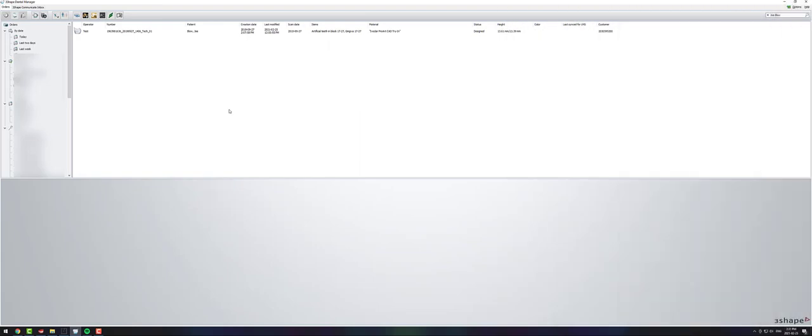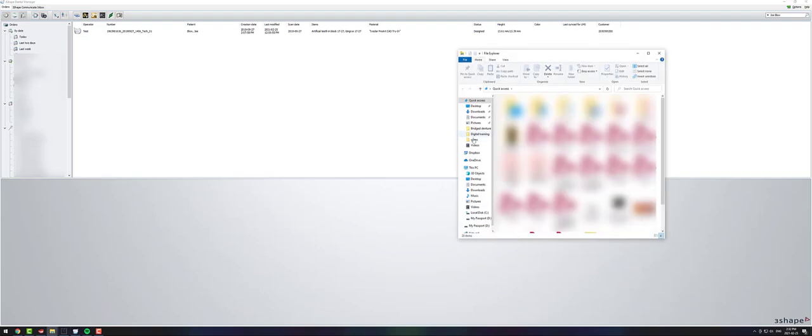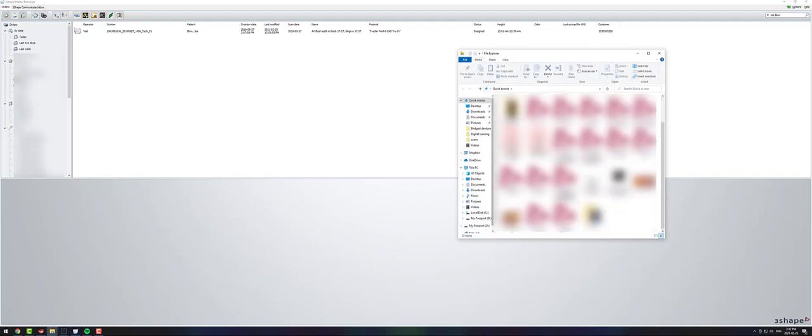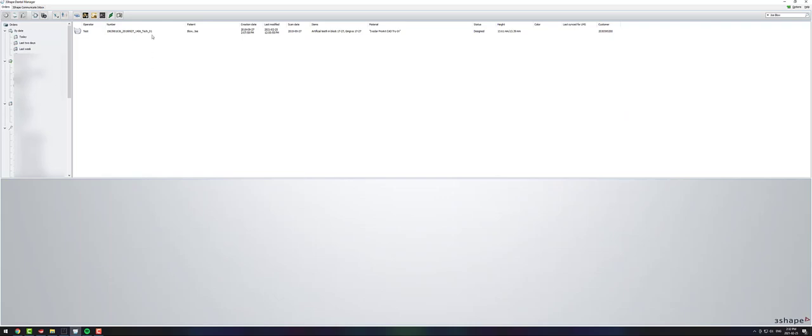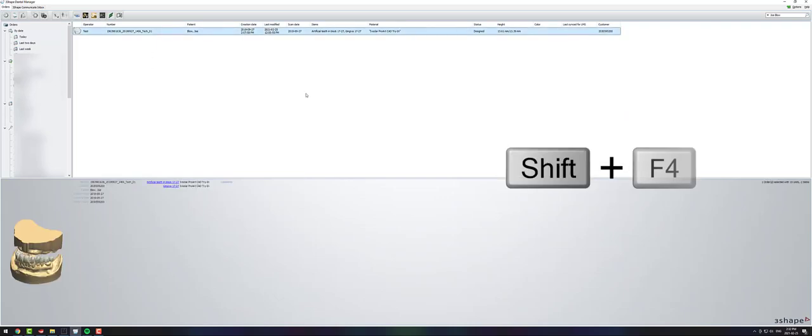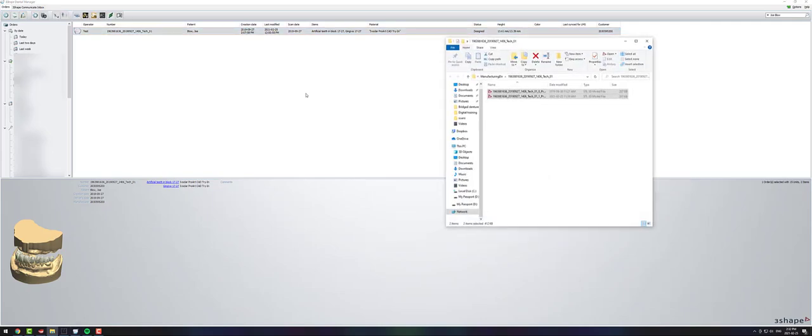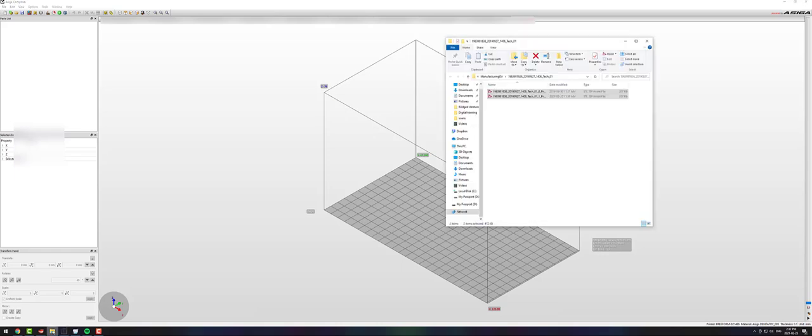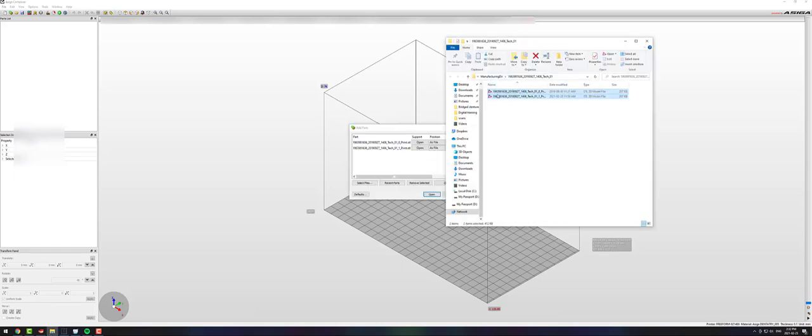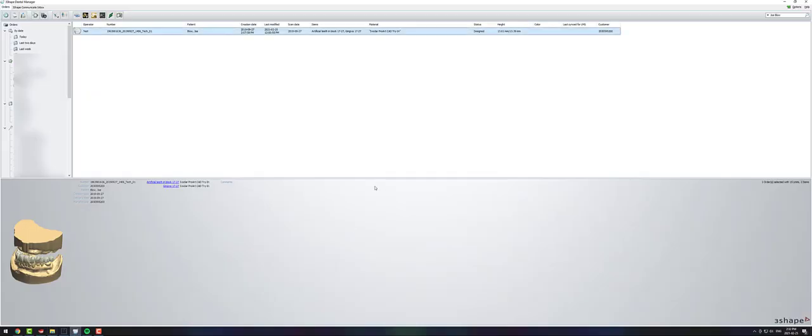If you ever want to open the file explorer, you can just click windows E and it will just open your general file explorer. If you highlight a case and you click shift plus F4, this will take you to the manufacturing drive for that specific case and show you all of your STL or CAM files, which is nice because you can just highlight them and drag them into your printing software. It makes it a lot easier than trying to find them later.